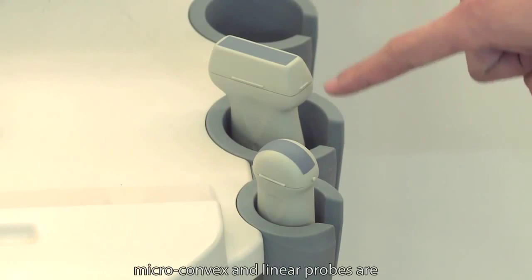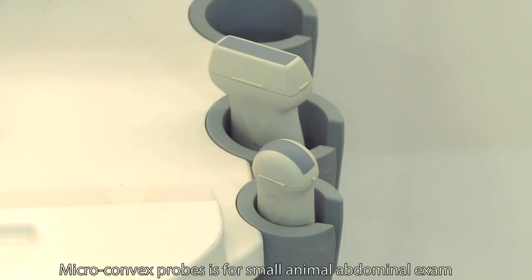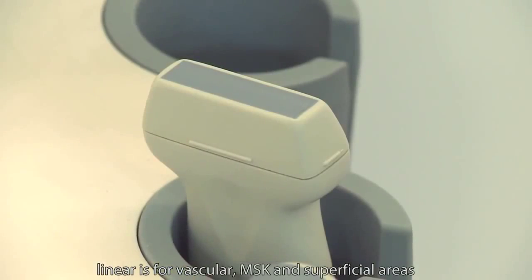Microconvex and linear probes are basic black and white probes for small animals. The microconvex probe is for small animal abdominal exam. The linear probe is for vascular, MSK, and superficial areas.